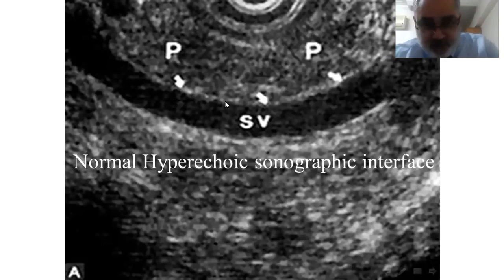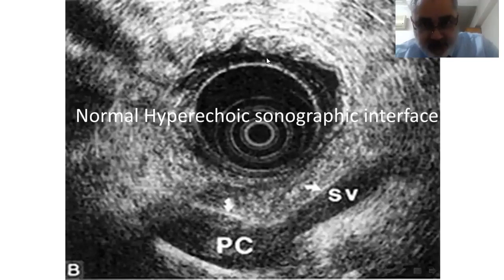And this is the line of interface as appearing in radial echo endoscope. This is the portal venous confluence, and this is the splenic vein. So this is a very nice line of interface. So here, this vessel is not involved.